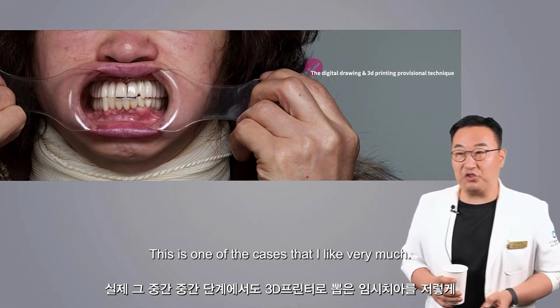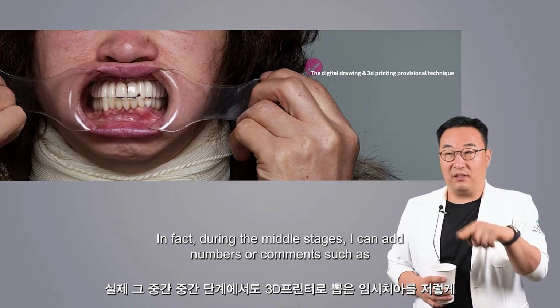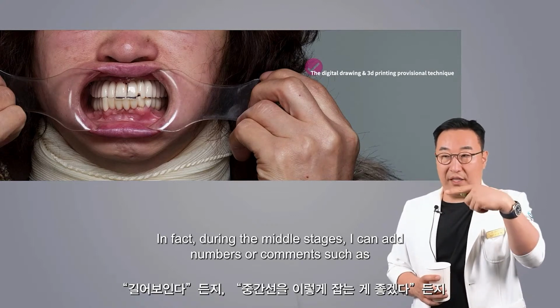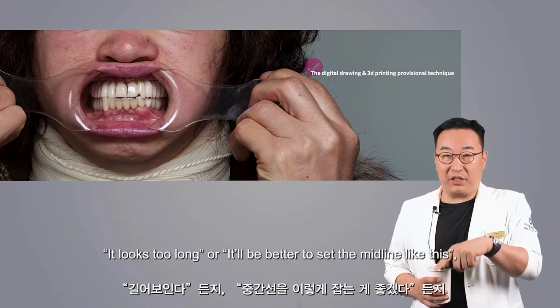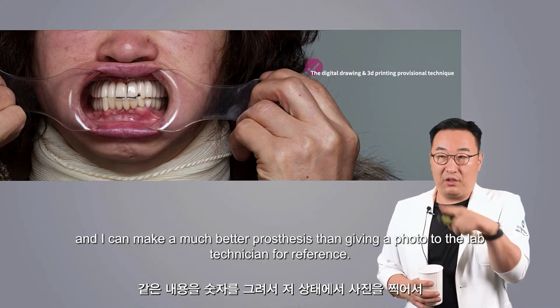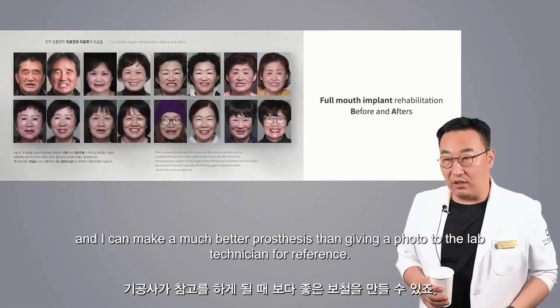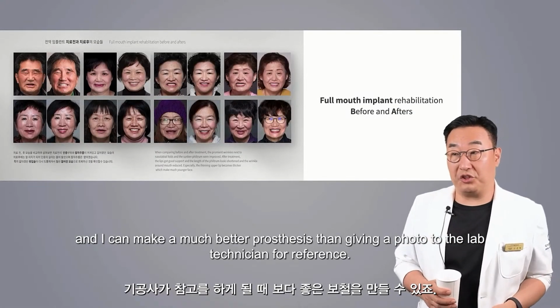In fact, during the middle stages, I can add numbers or comments such as, it looks too long, or it'll be better to set the midline like this, and I can make a much better prosthesis than giving a photo to the lab technician for reference.